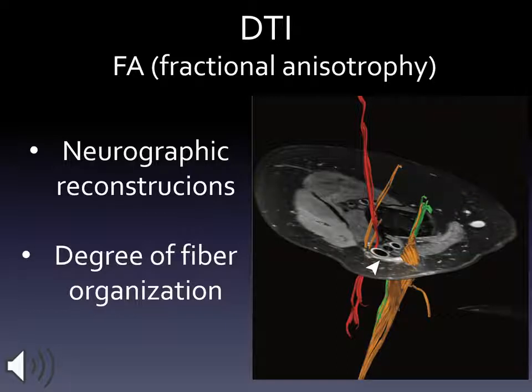A reduction in fractional anisotropy reflects loss of fiber integrity and normal anisotropy of the peripheral nerve structure, which can be due to an increase in extracellular water, as occurs in moderate peripheral nerve injury or damage of the inner or outer connective layers in major nerve injury.